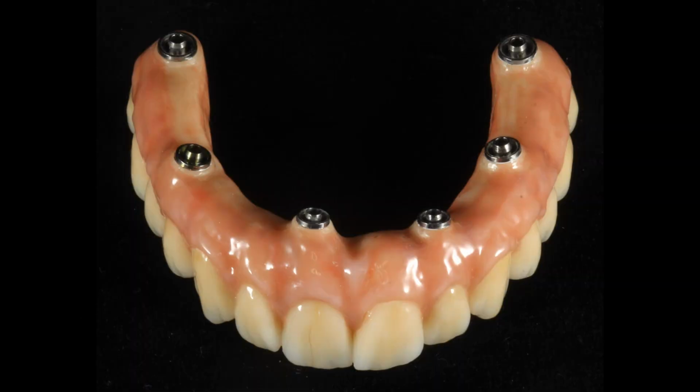Here's the frontal and top view of the final zirconium implant bridge. And like you've heard me say in many of my other videos, all the contours facilitate cleaning by the patient. Very, very rarely do we ever have to take these prostheses out to clean them for the patient. You'll have areas you can get floss in here if you will. We certainly want our patients to floss these, but most patients brush and water pick, and that is enough because everything is cleansable by the patient.